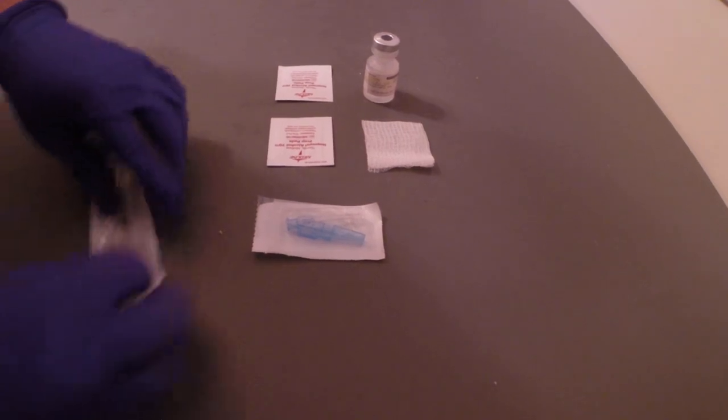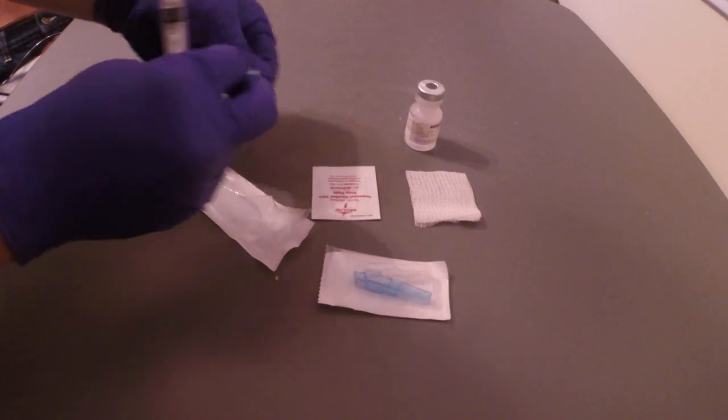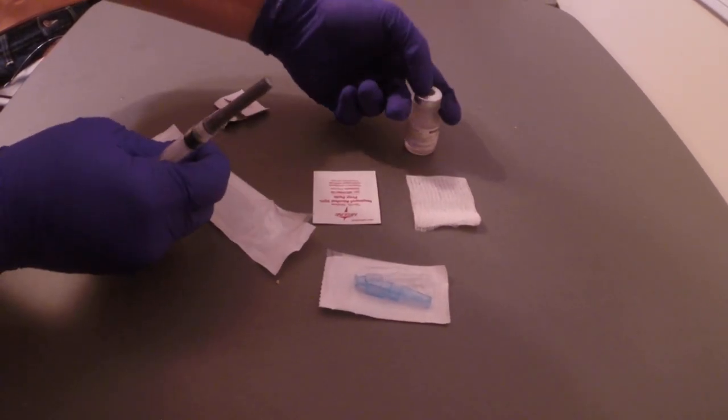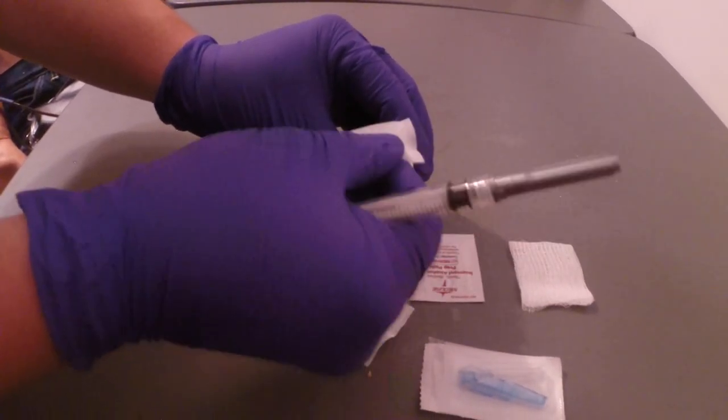So we're going to start by removing our syringe from the package which has a blunt cannula already attached. We would pop the top, the dust cap on our medication, clean the port.